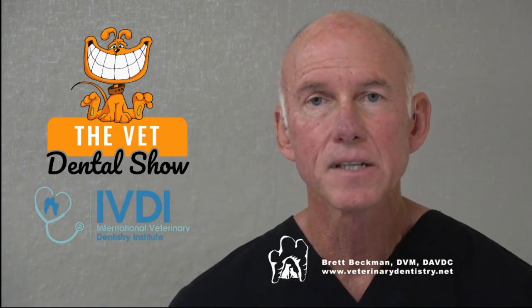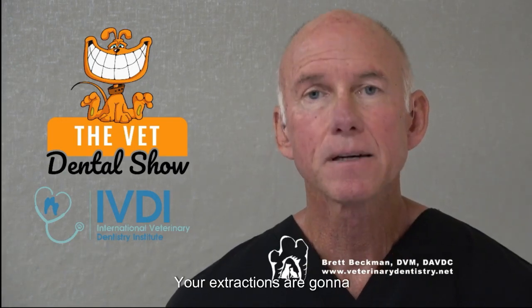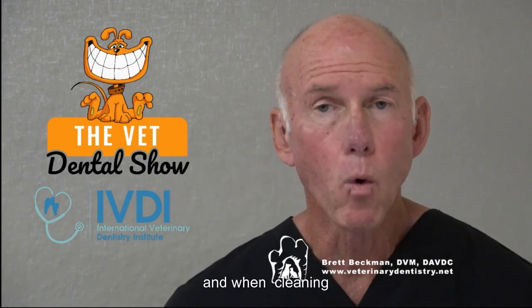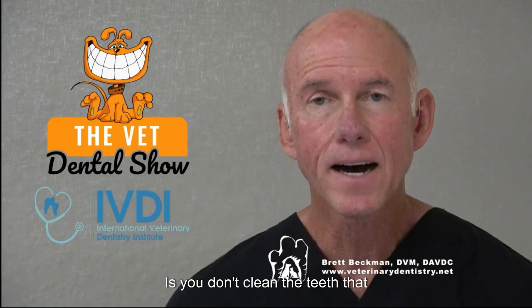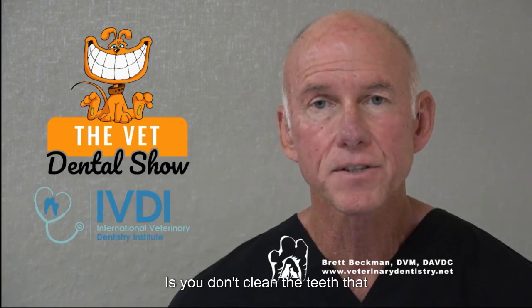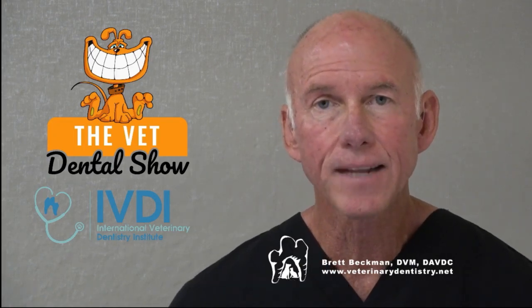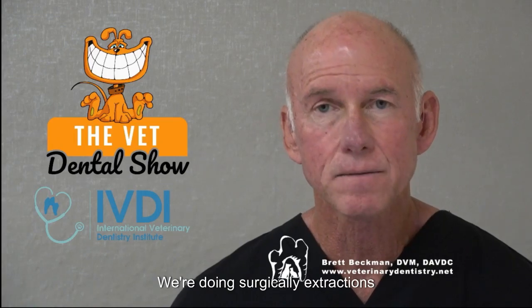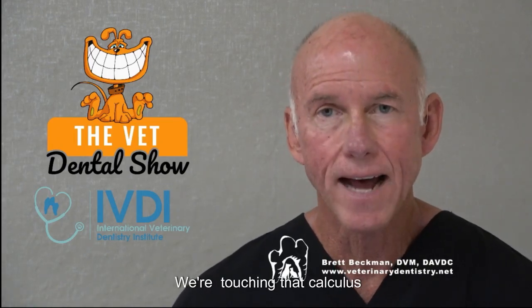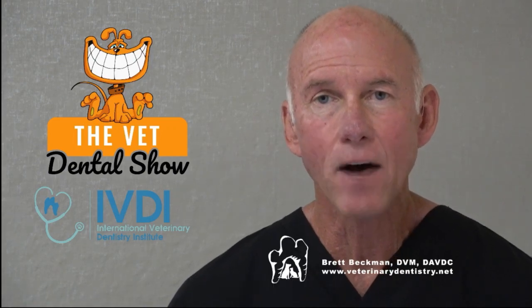Take your radiographs, find out what your extractions are going to be, and when you're cleaning, the other thing for maximal efficiency is you don't clean the teeth that have the calculus on them that you're going to be extracting. There's no reason to do that. We're doing surgical extractions here. We're not touching that calculus. We're exposing the bone and mucosa.